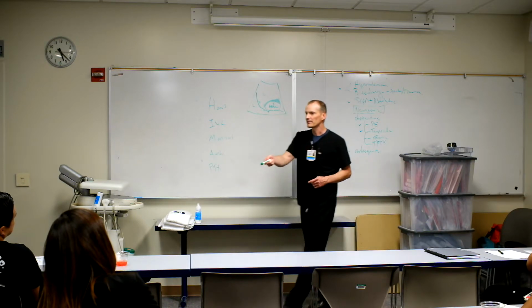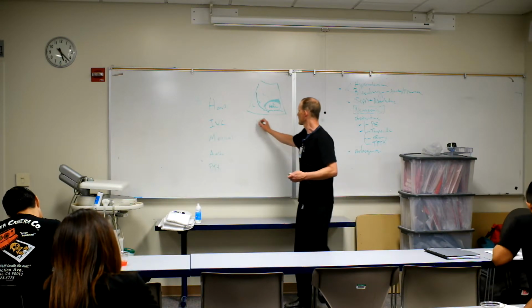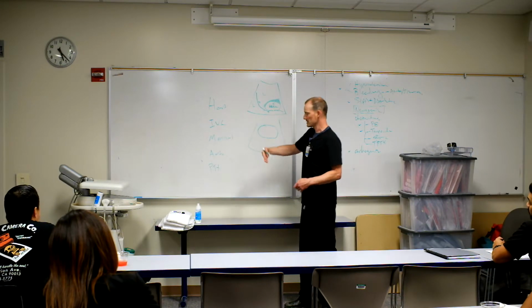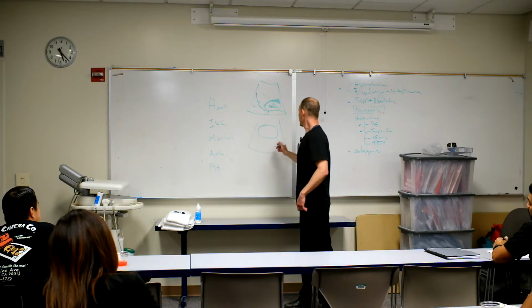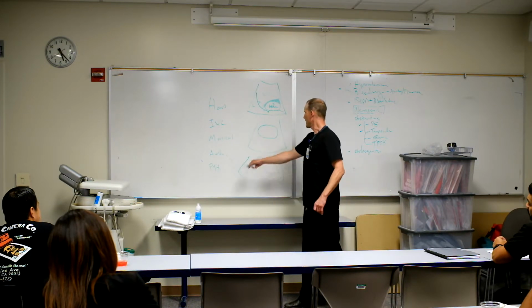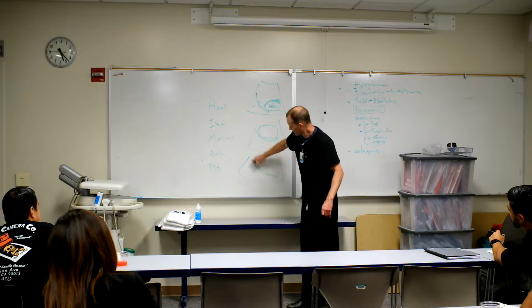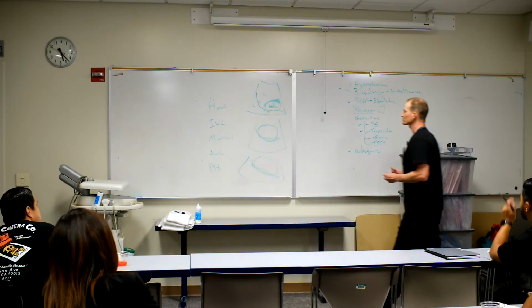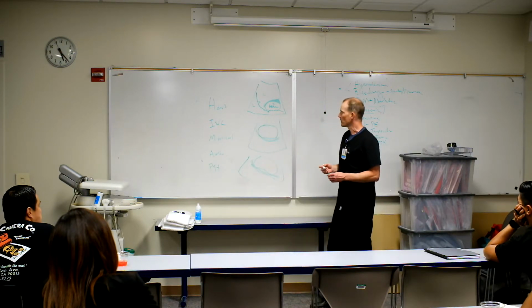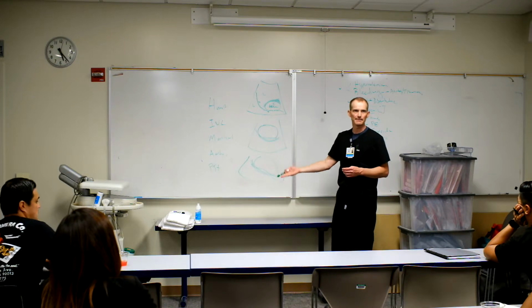But do they have the pelvis on there? They do, don't they? It says bladder view. Yeah, okay, so the bladder view is like this. You can put this in if you want. From the transverse way, it looks like that, and if you go sagittal, like this, it looks like that. And the blood will collect here, and the blood will collect here. Okay? So that's the Morrison's pouch, and you can throw on the pelvis if you wanted to at the end, but I think if there's enough blood to make them shocky, it should show up there, especially if they're laying supine. Okay?